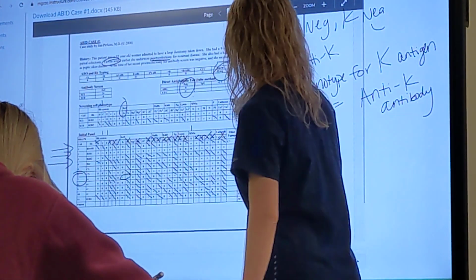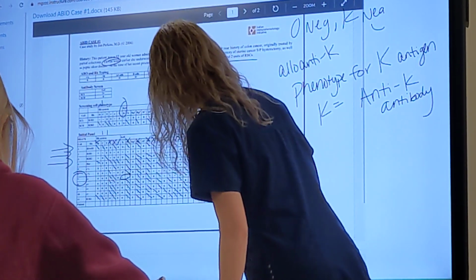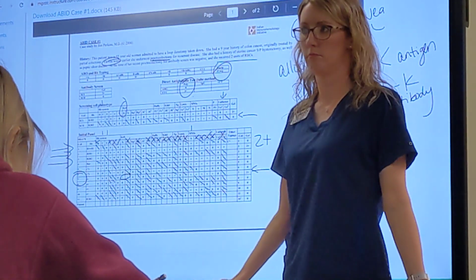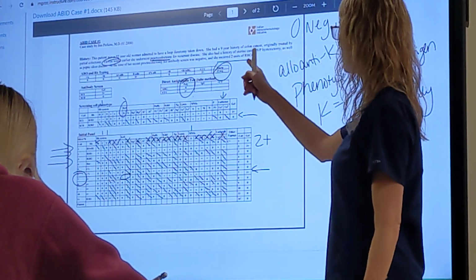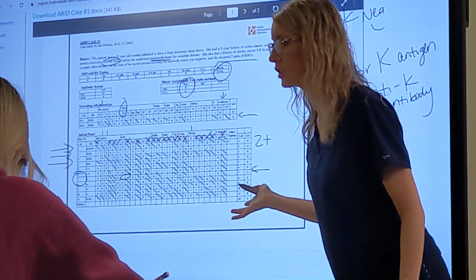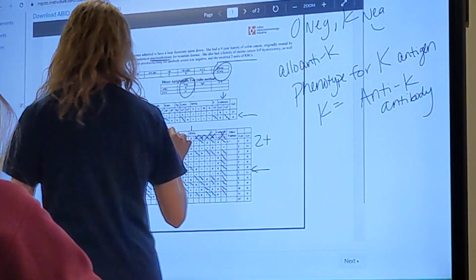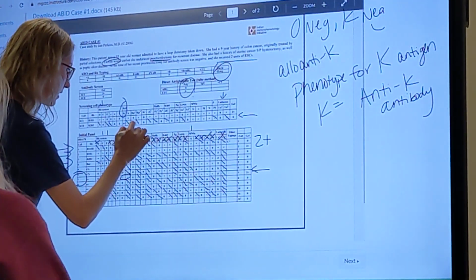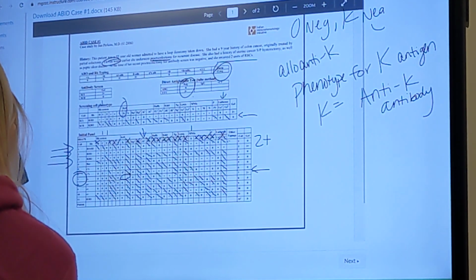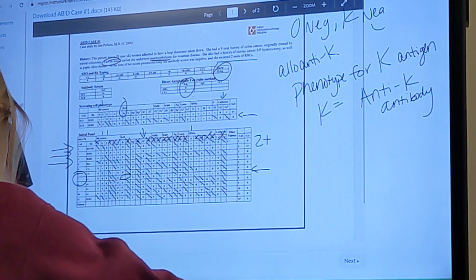And so that's why we're not really worried about Lutheran B, or Lutheran A, whatever. We didn't rule out Lutheran A, but only 1 out of those 13 people has the antigen. It's low frequency. Even if she got 20 units, the likelihood that she got exposed to a Lutheran A antigen is not likely, because most people don't have it. Does that make sense? We also said we're not really worried about JSA. Nobody has it. That's why we don't really worry about it. Because if nobody has it, even if they're being transfused, they're not being exposed.